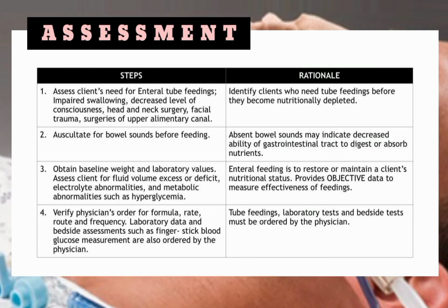For the assessment, assess client's need for enteral tube feedings: impaired swallowing, decreased level of consciousness, head and neck surgery, facial trauma, surgeries of upper alimentary canal. Identify clients who need tube feedings before they become nutritionally depleted.